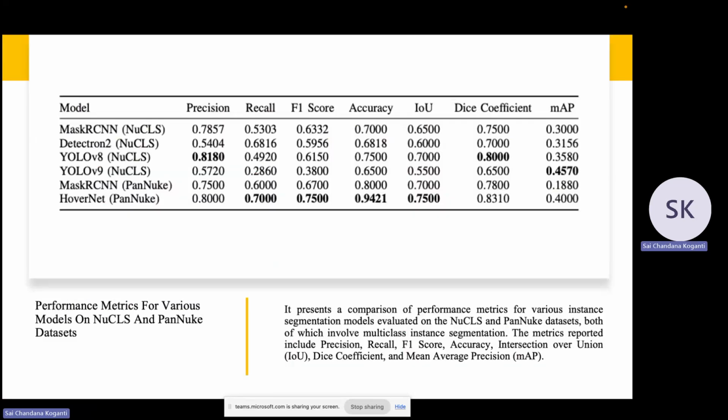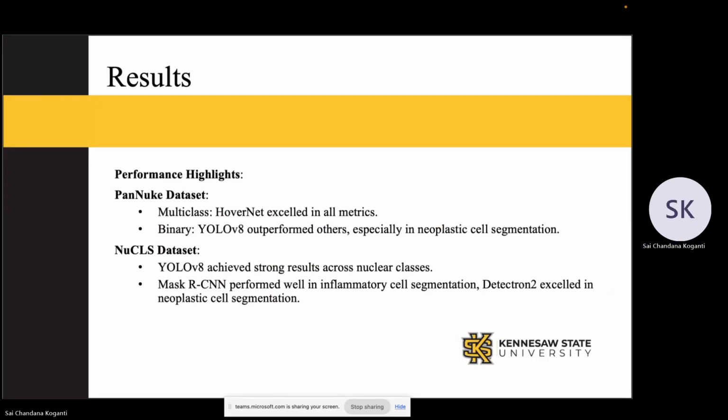Now this is multi-class instance segmentation, but with both the Nucleus and PanNuke datasets. Here I have used Mask R-CNN, Detectron 2, YOLO V8, YOLO V9, and also HoverNet, with different types of evaluation metrics. You can have a look at this now.